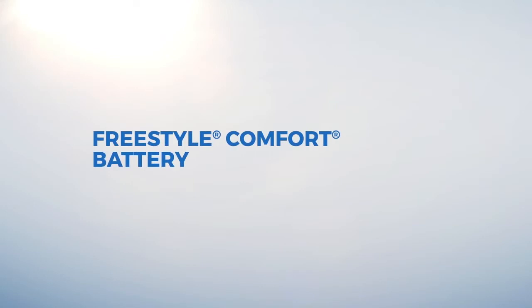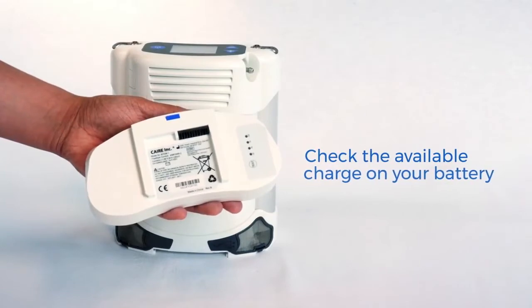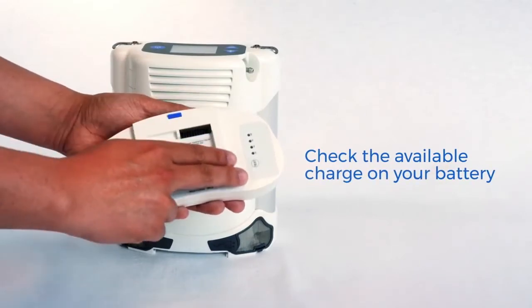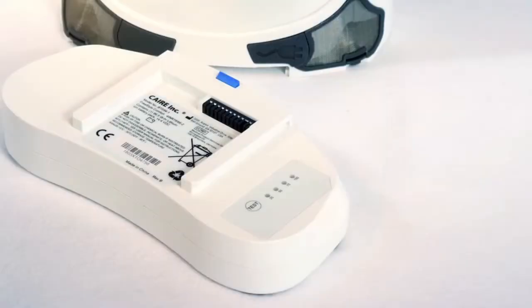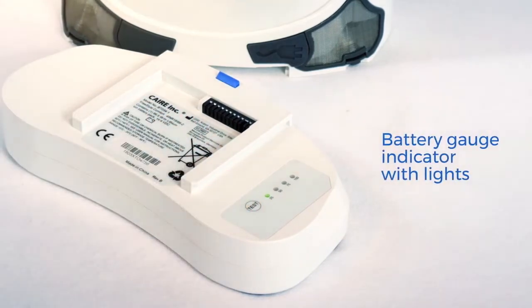Your Freestyle Comfort ships with its battery removed. Before your first use, you will want to check the amount of battery charge available. Your battery will arrive partially charged and should be fully charged prior to use. To check the battery charge, look for the battery test button on the top of the battery. Press the test button and the battery gauge indicator lights will illuminate above the button to indicate the percentage of the battery pack charge.